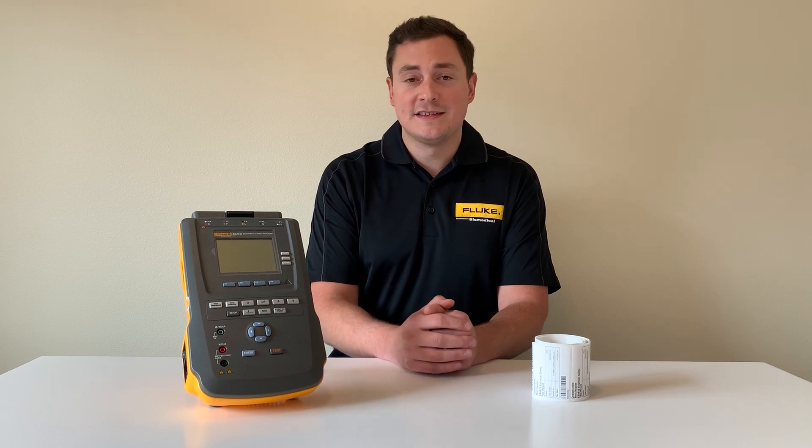The ESA 614 and 615 have built-in procedures that you can execute with a push of a button that meet those standards. Once the test data is on the device, you can pull it off over USB using the ESA 614/615 test results converter, or you can pop out the SD card and put that in your computer.